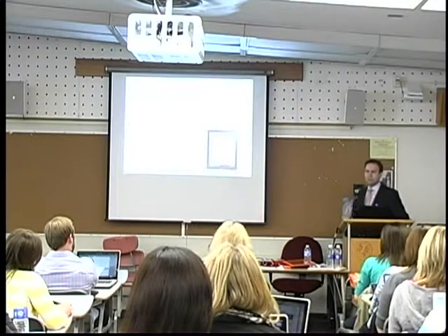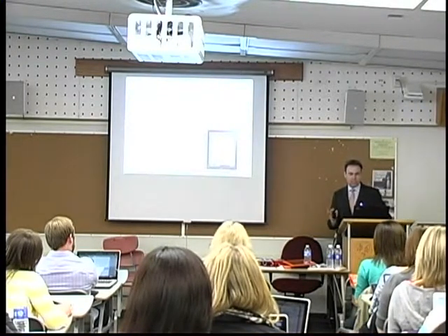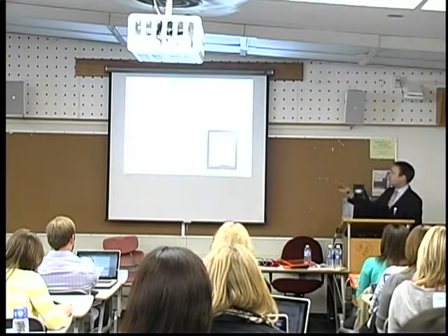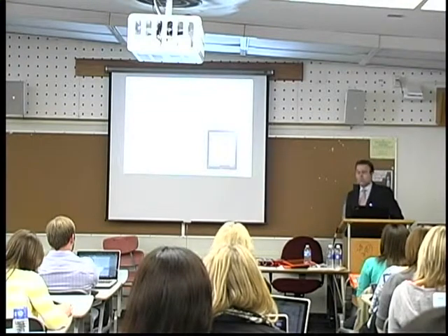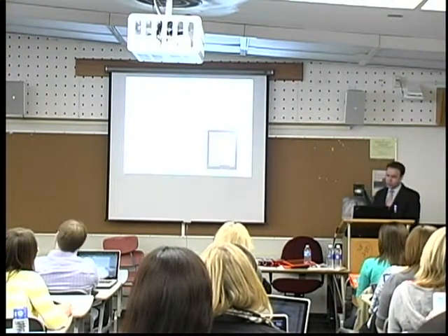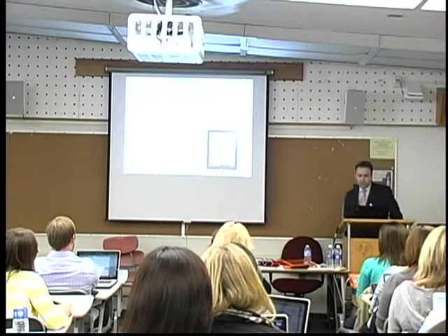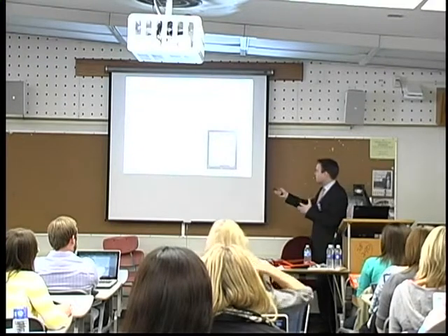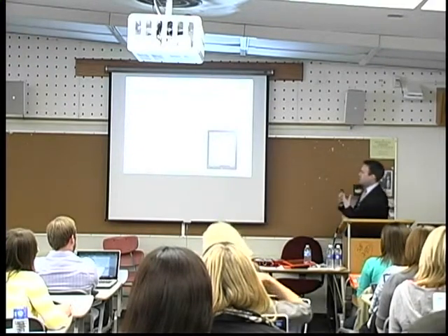A huge movement currently, I'm sure you're all aware of this, is towards using iPads and other tablet devices. Some strong arguments for those are that these devices are lightweight and portable. They tend to be very cost efficient compared to dedicated speech generating devices. They are fairly easy to program and intuitive to use. Also highly motivating to use because kids are usually drawn towards this interface. It's highly appealing to them.